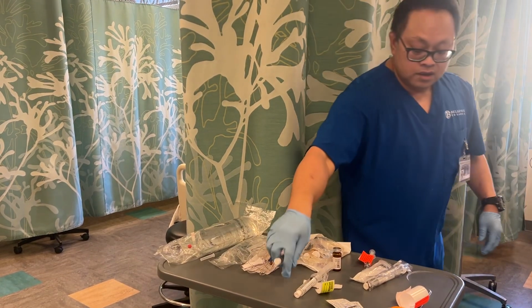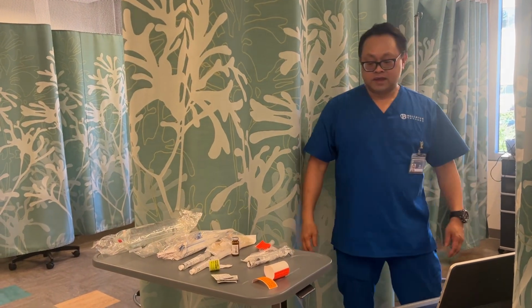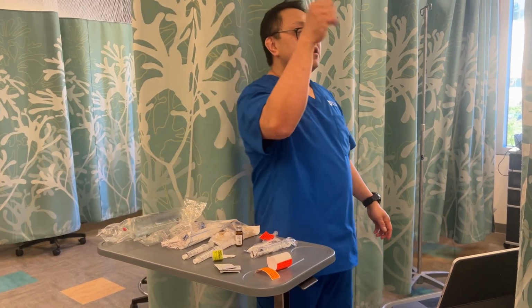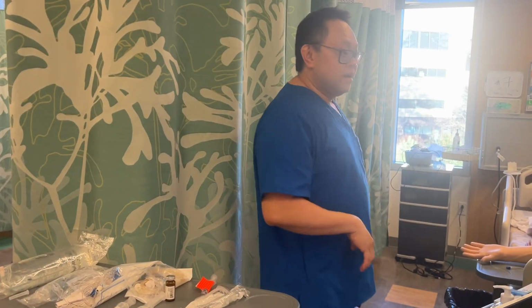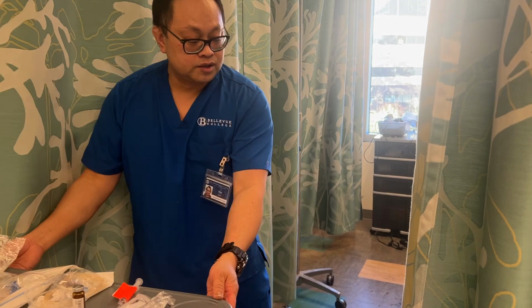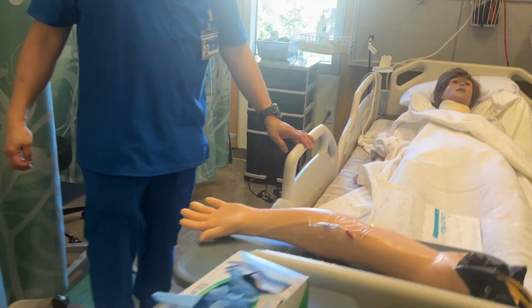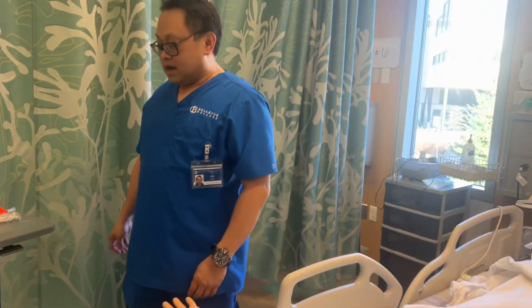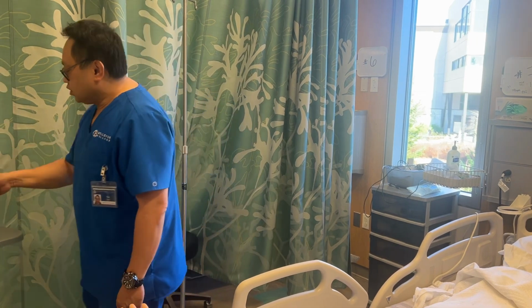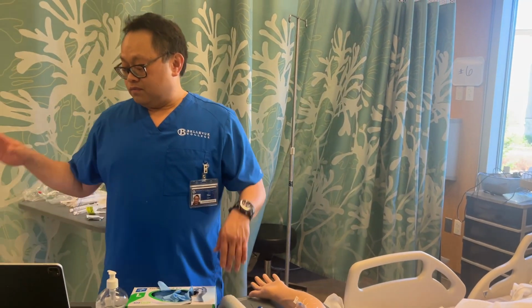Okay. All right, so I'm ready to pull the medication. I'm going to sanitize and gather my supplies. Knock, knock. Hello, hi, my name is Ty, and I will be your nurse today. Can I have your full name and birthday, please? Yeah, Urena Tract, 9999. Thank you. And I'm also going to double confirm. I'm going to confirm her wristband and confirm each medication to see if it was the right patient.